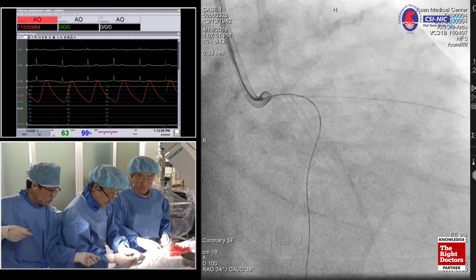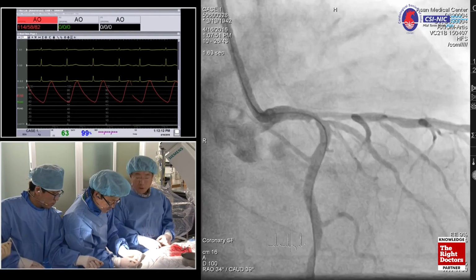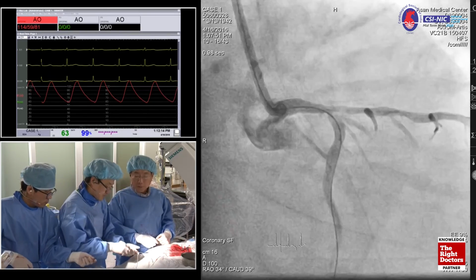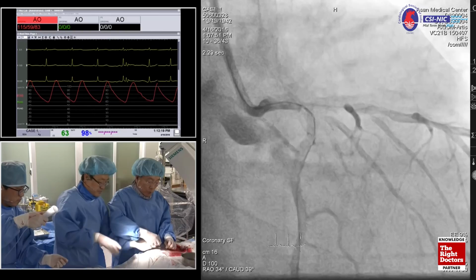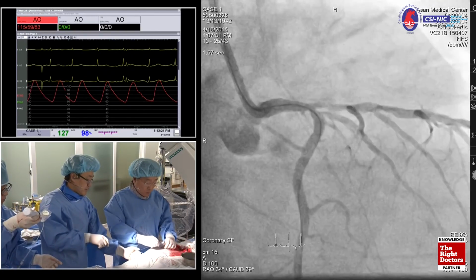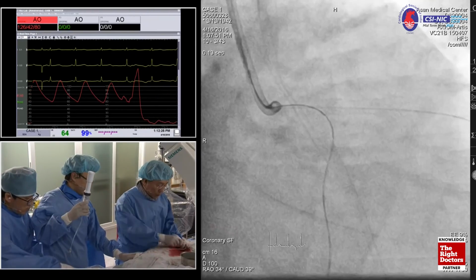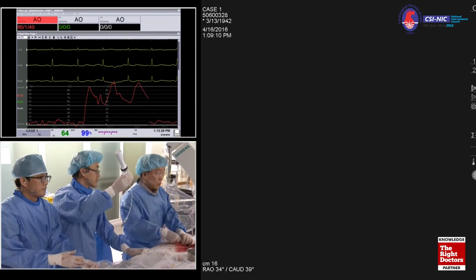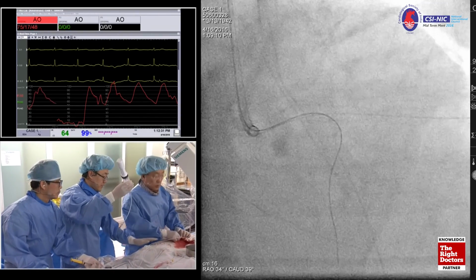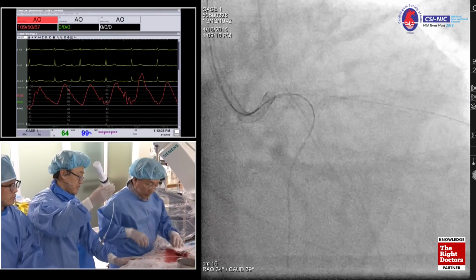So still I prefer the bigger the better. For complex angioplasty, like left main, we still want to move to transradial, low profile. However, for this kind of complex procedure, bifurcation, left main, I prefer bigger ones. Sometimes, this is something. Side branch. Yes. Okay, right.